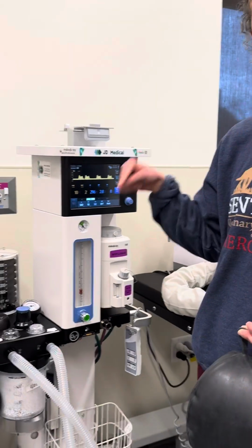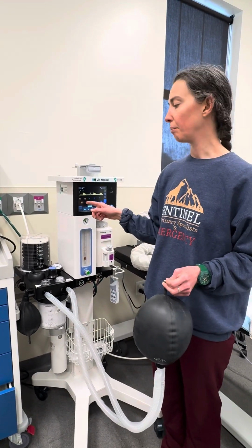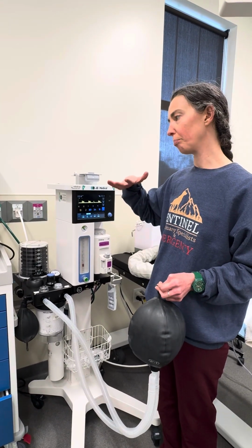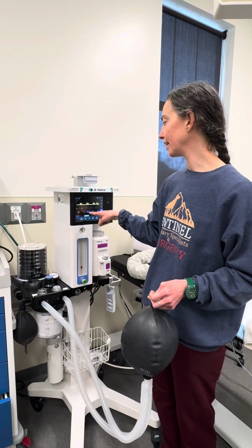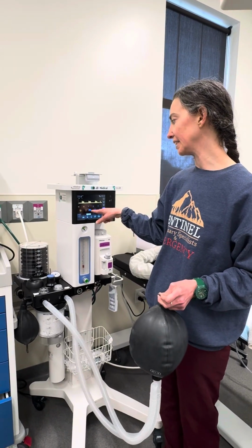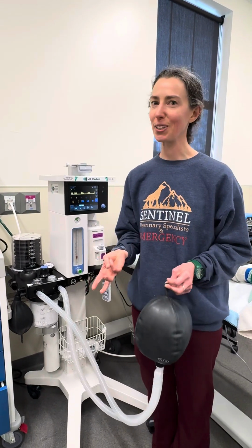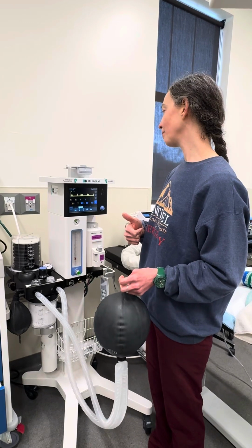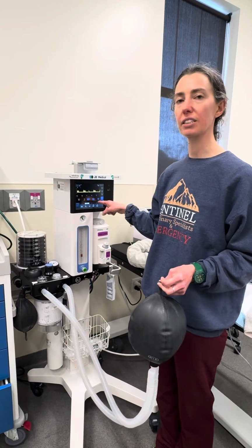PEEP is positive end expiratory pressure, and it's always going to be 2 to 3 because the bellows is ascending and it needs a little bit of end expiratory pressure so the bellows stay up. And then it's telling you it's giving 297 mils and you're asking for 300. It's 3 mils difference. We're going to be totally fine with that. And then it's telling you what rate the ventilator is giving those breaths at.